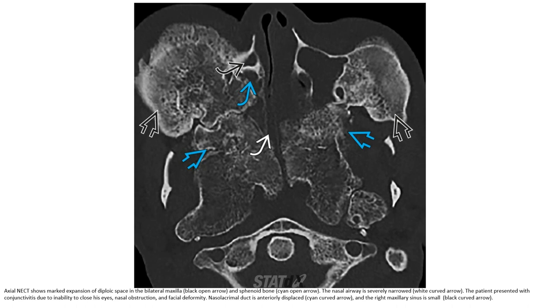This is the non-enhanced CT showing marked expansion of the diploe space in the bilateral maxilla and sphenoid bone. The nasal airway is severely narrowed. The patient presented with conjunctivitis due to inability to close his eye, nasal obstruction, and facial deformity. The nasolacrimal duct is anteriorly displaced, and the right maxillary sinus is small.